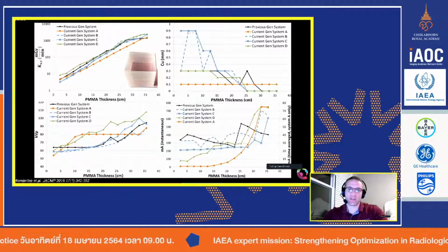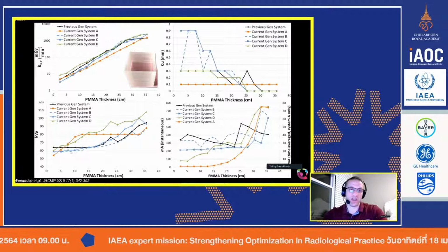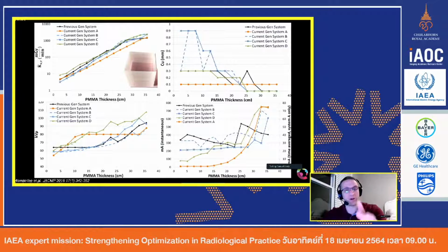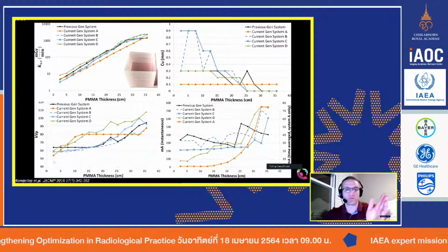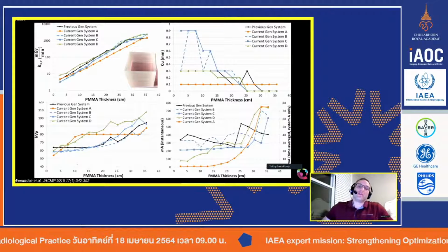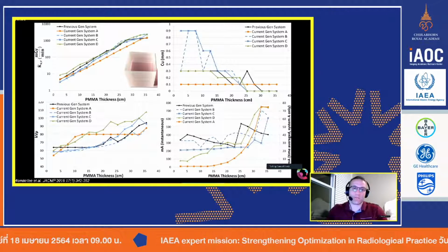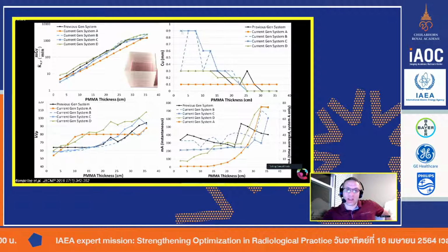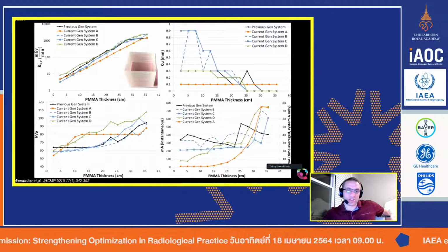Because they have such thick filters initially, they do not have to aggressively change the KV at first. So the resolution will be lower, but the contrast will be more constant over this range of patients or this range of patient thickness. So if you're going from maybe a thicker abdomen or a thinner abdomen to the pelvis, etc., however that attenuation profile changes, this X is pretty consistent.